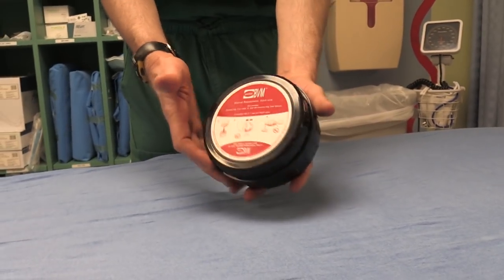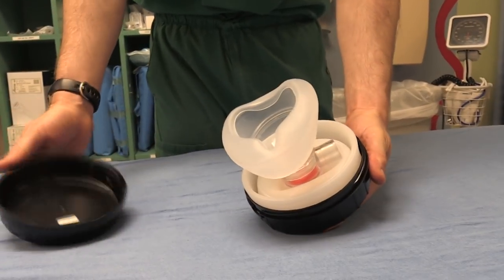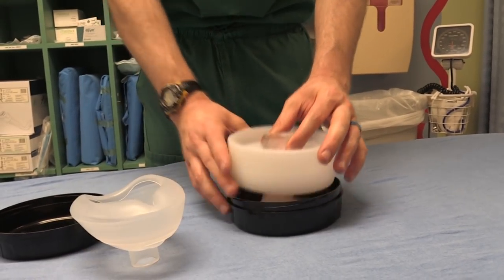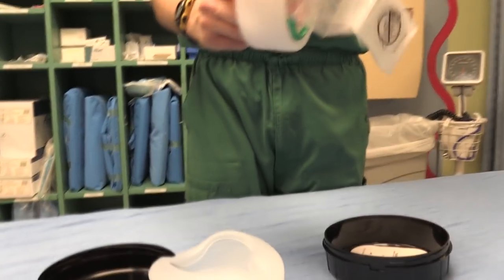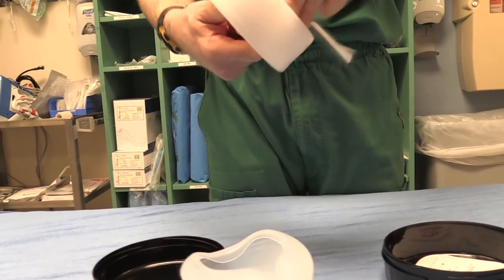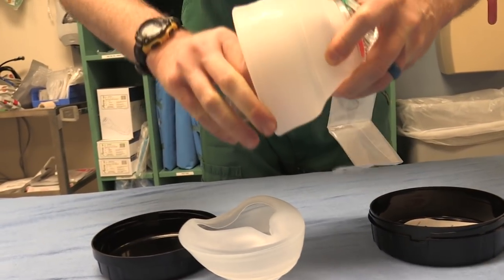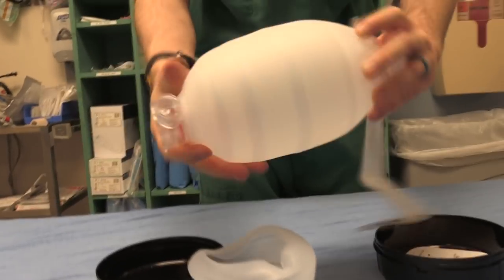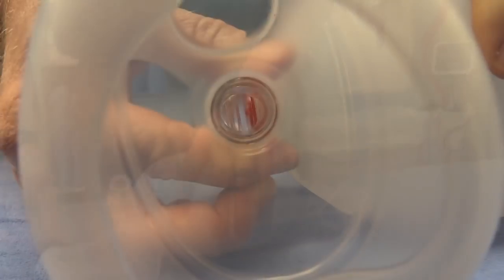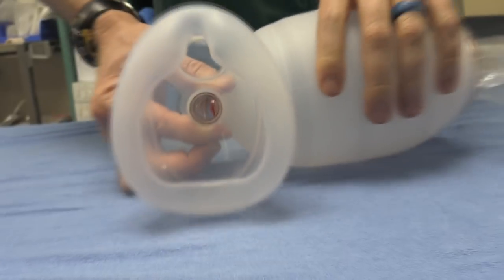So here we go. We're going to just twist, and it has that spring that kind of opens up. And it told us to take the mask off, so that's right. We're doing that, and then to take this out. Does this one have oxygen tubing with it? This one doesn't. Okay, so that's the difference. Make it smooth, Tim. Come on. There you go. It's not bad. It's nothing negative. Beautiful. I like it.